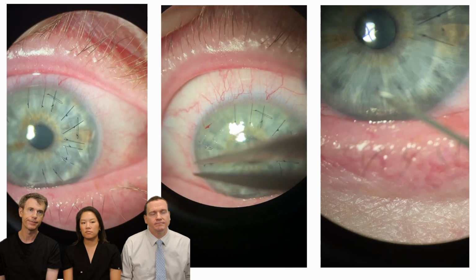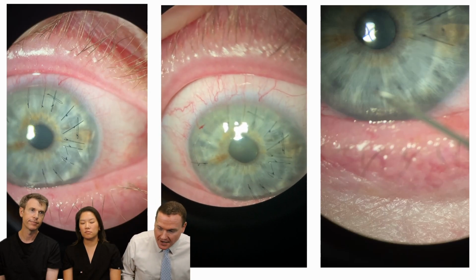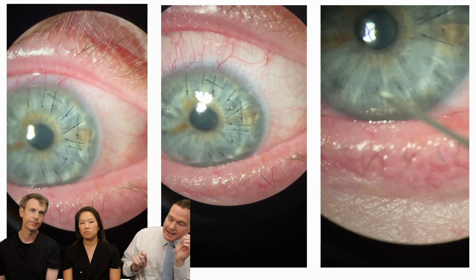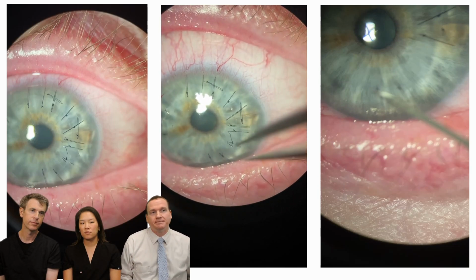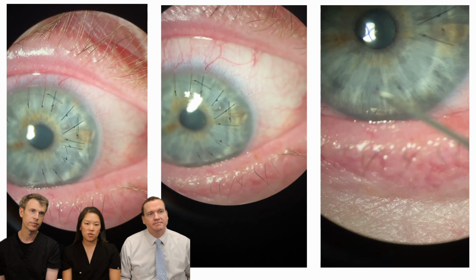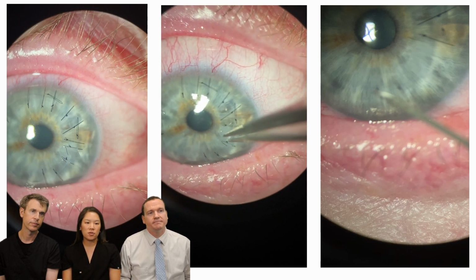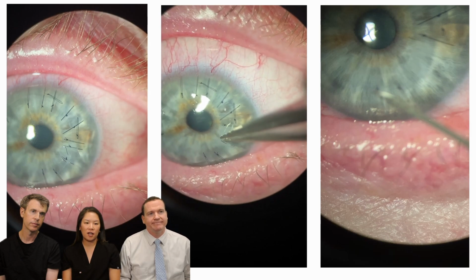How much of a problem is it, and I'm asking for somebody else, a friend, if you break the suture and it gets stuck in the cornea? It's not really a problem. Sometimes we leave these sutures in for a very long time. So as long as the suture is not exposed and is buried, then it should be fine.